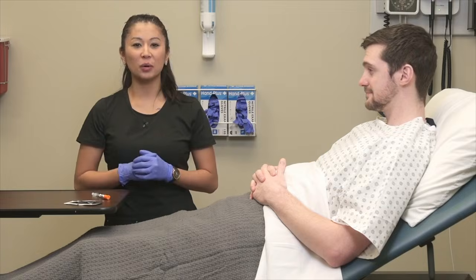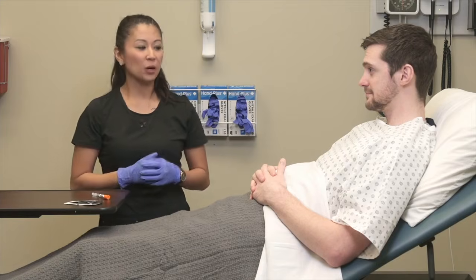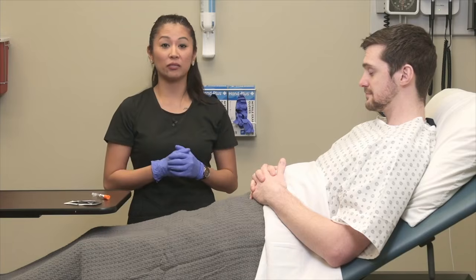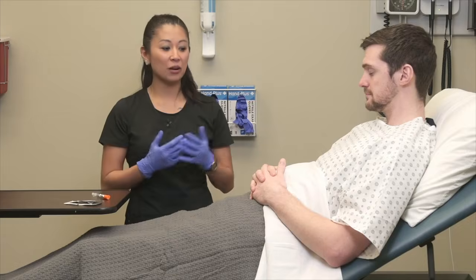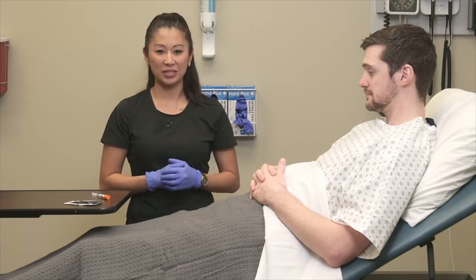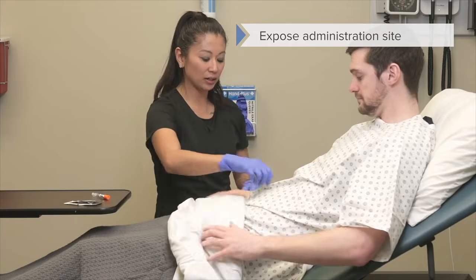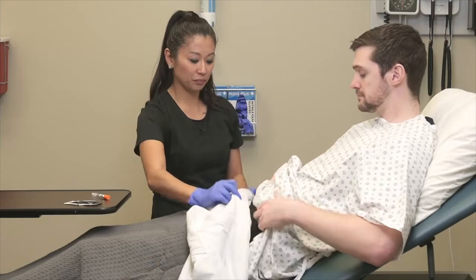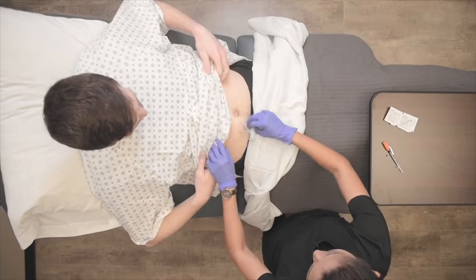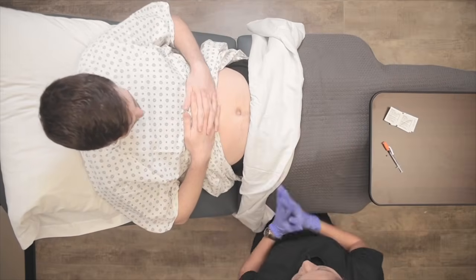Now that we've drawn up our medication, let's take a look at the actual injection itself. We want to make sure our patient's nice and comfortable, then we're going to choose our injection site. For this demonstration, I'm going to use the abdomen. Alright, so then I'm going to expose the site, but also try to leave the patient as covered as possible. I only need to expose a little bit of the patient's abdomen to give this injection.